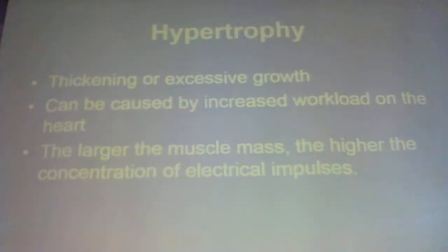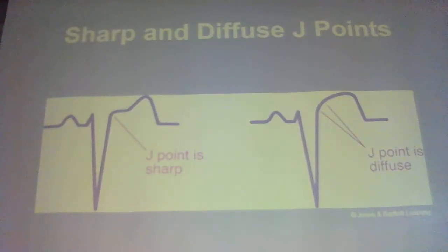Alright, so, can we diagnose an MI in the setting of a left bundle branch block? Okay, get your pens out. You go cat lab anyway. Huh? You go cat lab anyway. I'm fixing to blow that myth.